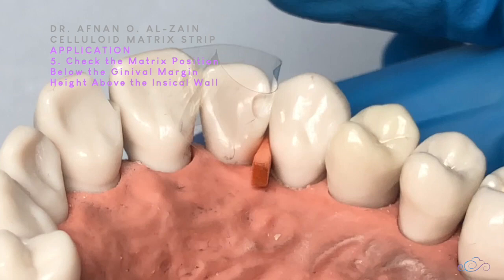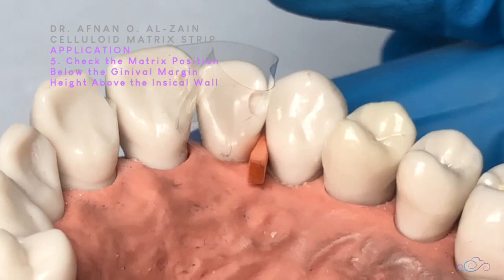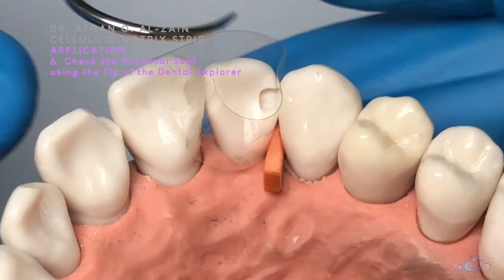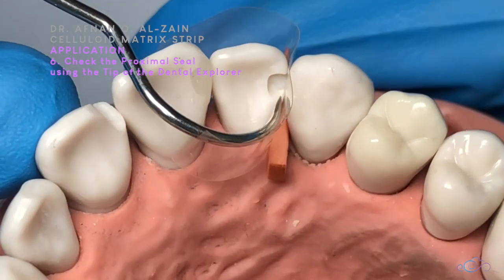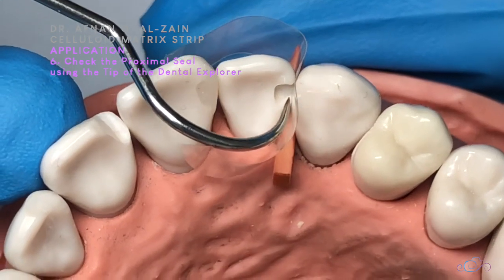We confirm the margins so that nothing goes wrong while doing the restoration. Then I'll confirm that there is a proper seal, so there are no issues during the restoration procedure.